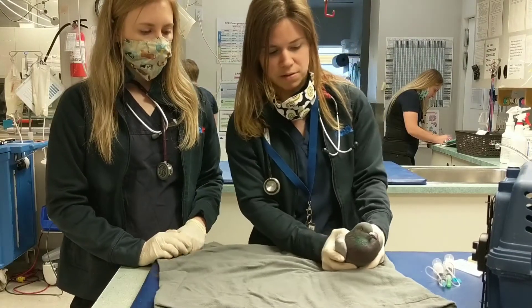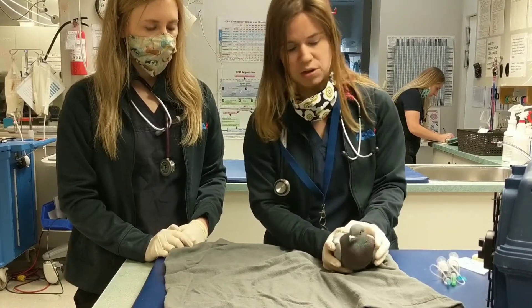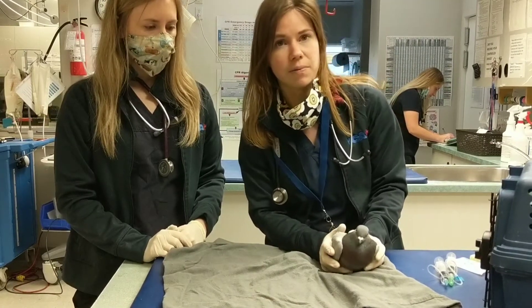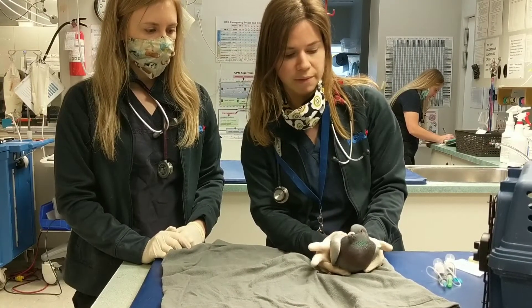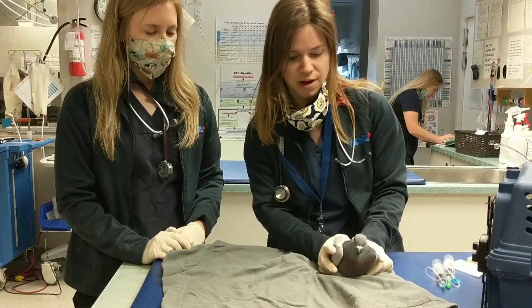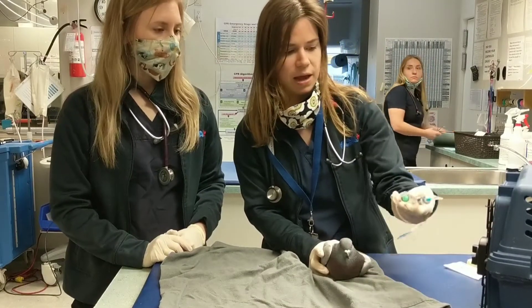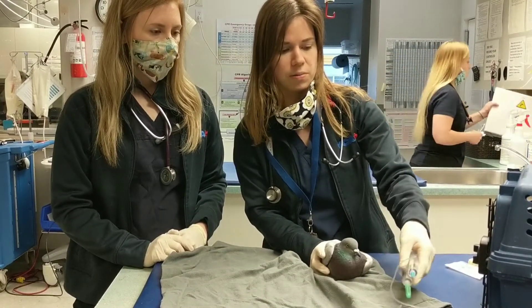We already did the exam, so you can plan how to do an avian exam on another video. But just make sure that you have all your supplies ready before you give the subcutaneous fluids: gloves, a patient towel for restraint, a restrainer, and then a butterfly needle and the appropriate volume of subcutaneous fluids.